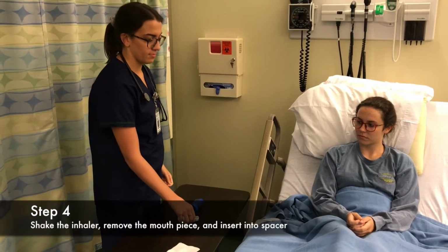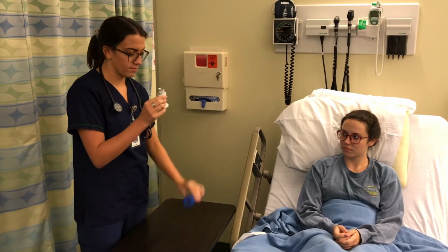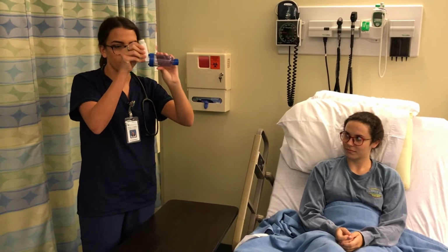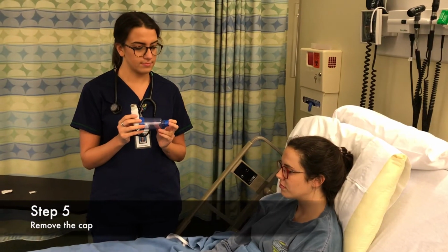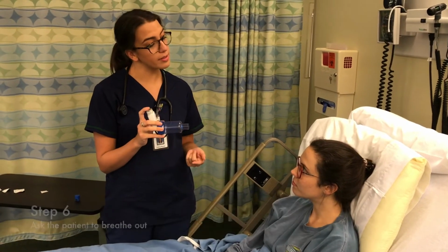Shake the inhaler. Remove the mouthpiece cap of the inhaler and insert the mouthpiece into the spacer while holding the canister upright. Remove the cap from the spacer. Ask the patient to breathe out slowly and completely.